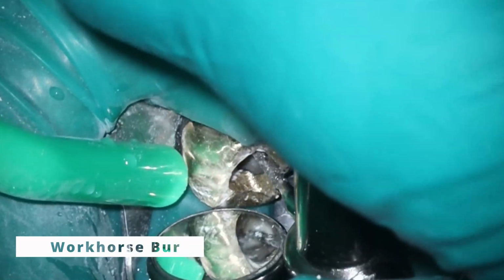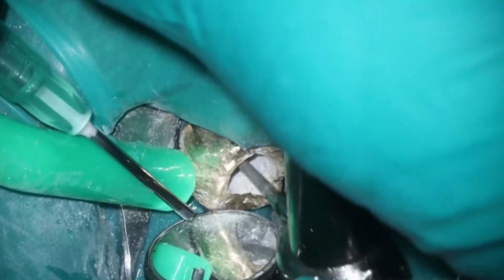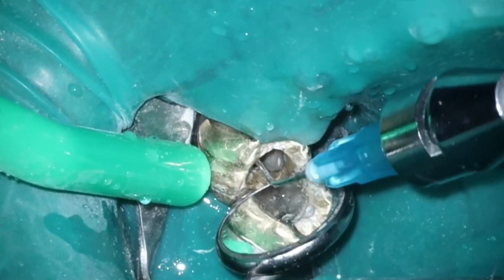As you can see, with the workhorse burr they didn't unroof everything. It's because of how the tooth was angled and how he was angling. I understand how the axis was off. Definitely a larger axis than I would have preferred to have done, but it's okay. He's here now. We're going to get him all taken care of. Now, when I get inside here in a second, what you'll notice is something quite surprising as far as the tooth. I do all these live and I don't time it out properly as I should have.